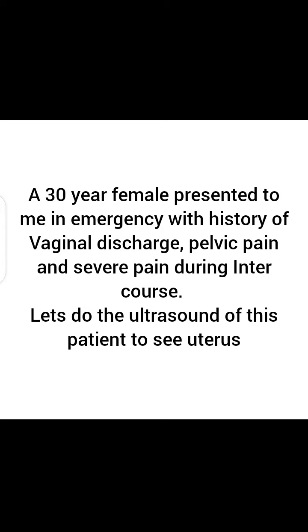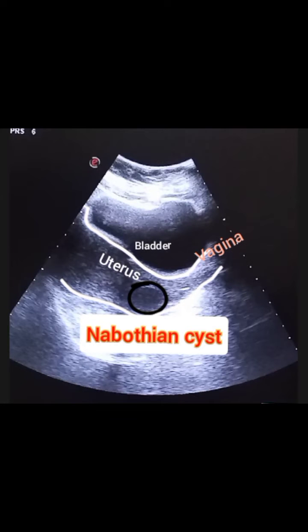Hello and welcome to another interesting video of my YouTube channel. A 30-year-old female presented to me in emergency with history of vaginal discharge, pelvic pain, and pain during intercourse. Let's do an ultrasound, so this is the picture of the ultrasound.